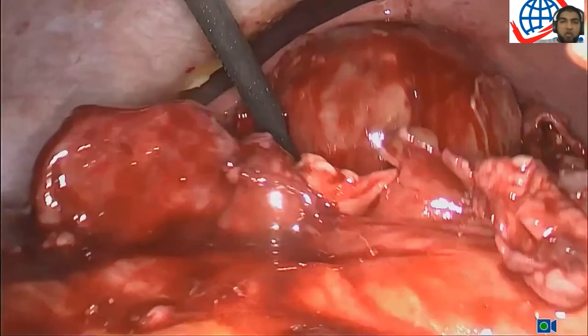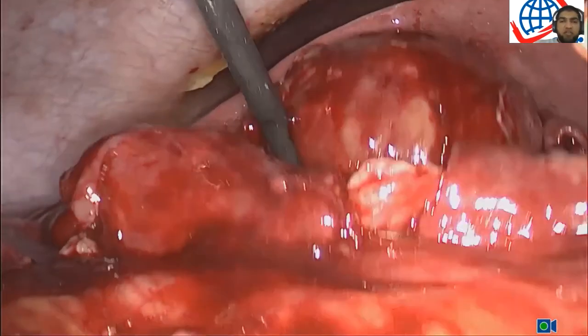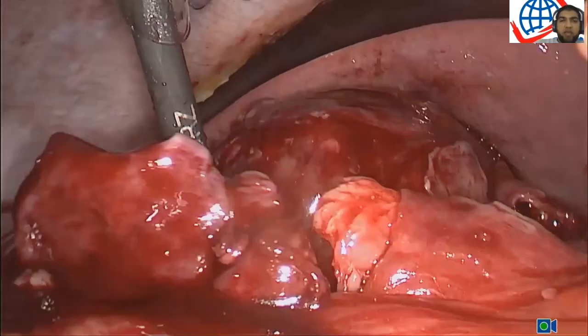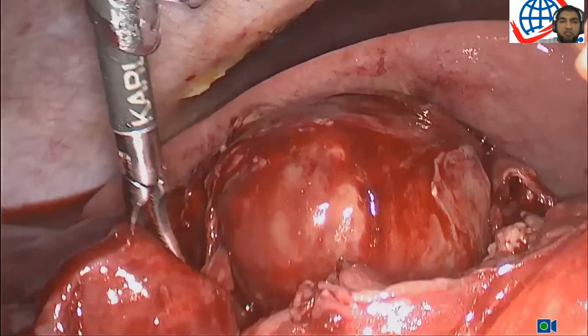Stay close to the gallbladder. You can see here, we're trying to stay close to the gallbladder. And we're trying to gently push everything away just so that we can slowly work our way down to the Calot's triangle.